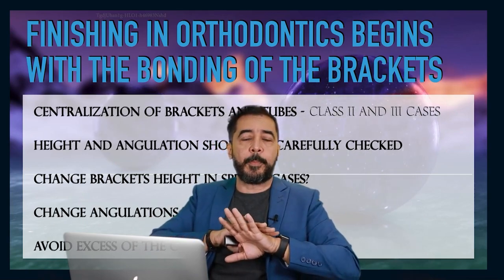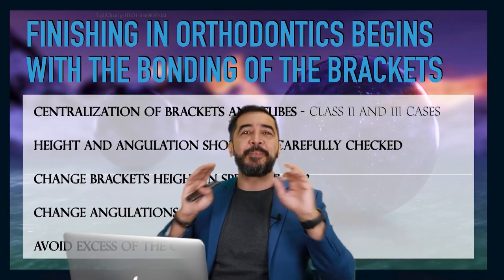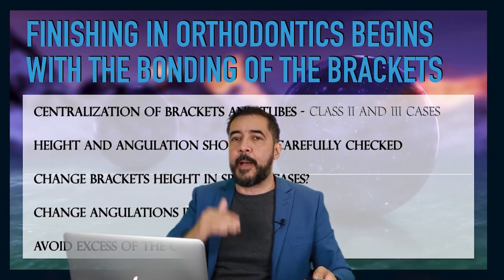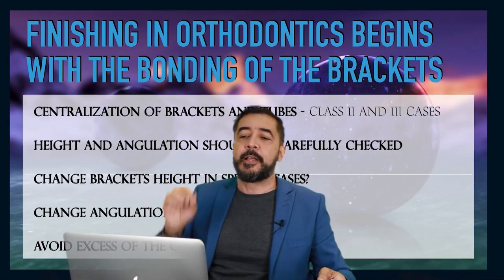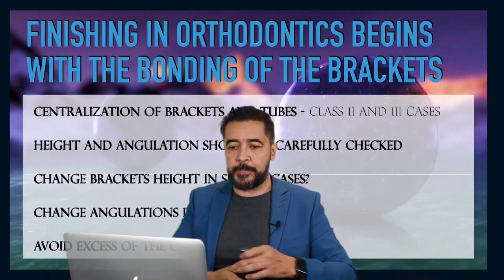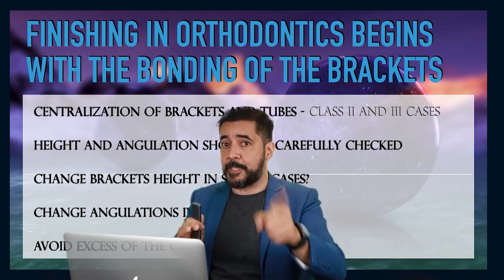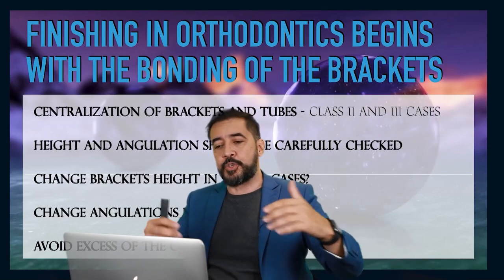Of course we can't eliminate them at all, but we can lower the amount of bends and loops that we have to do in order to correct something that was incorporated to the treatment in the beginning of the treatment. So let's do the thinking of not committing these mistakes, okay? This is what I'm calling you now to understand and to do with me.